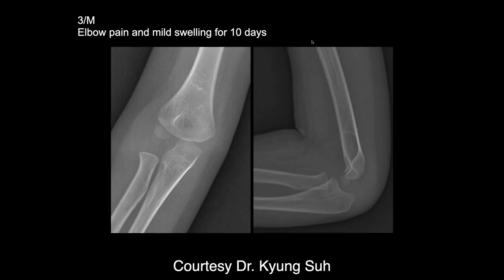We have a three-year-old male with elbow pain and mild swelling for 10 days. We can see the ossification center of the capitellum, which is normal for this age. Of course, the other ossification centers are not yet present.